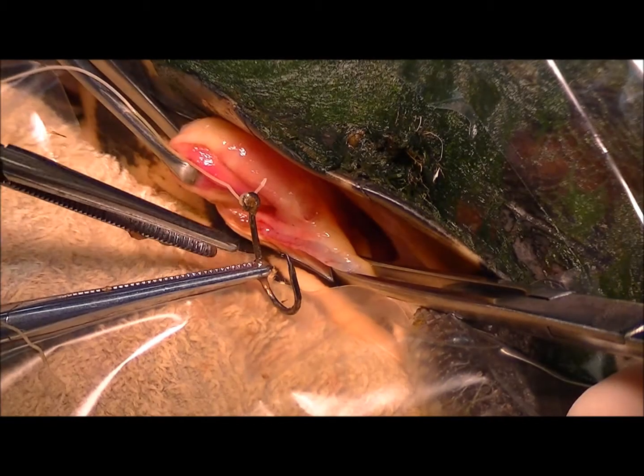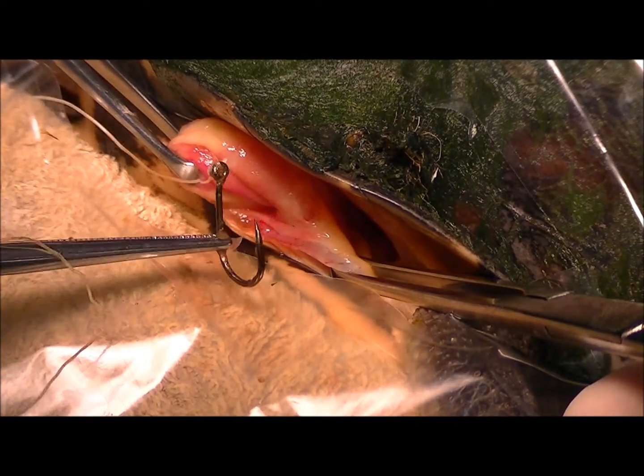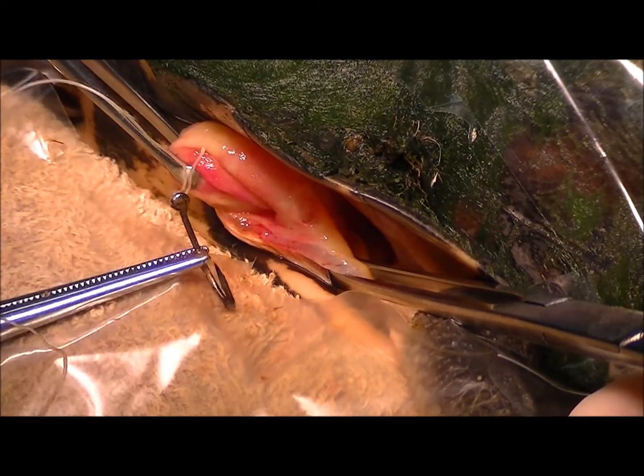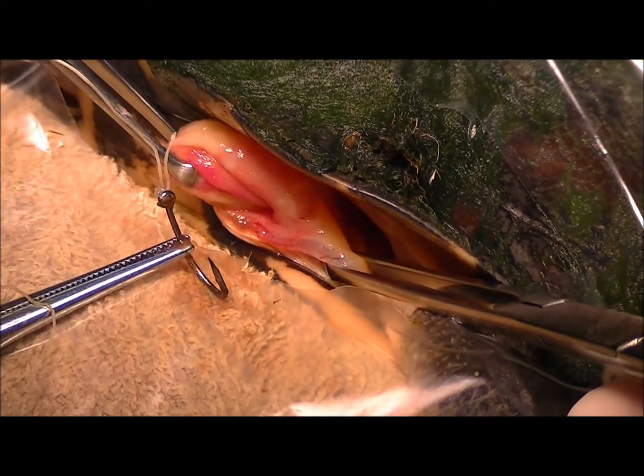So there's our hook. Not particularly rusted, so I don't think it's been in there very long, but we've managed to get that out pretty quickly actually. So we're going to close up that stomach wall now, and then the muscle, and then the skin, and wake this turtle up.